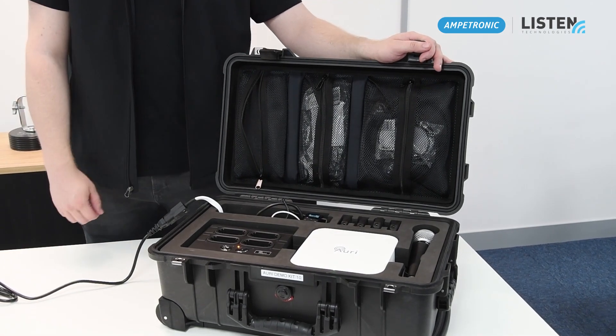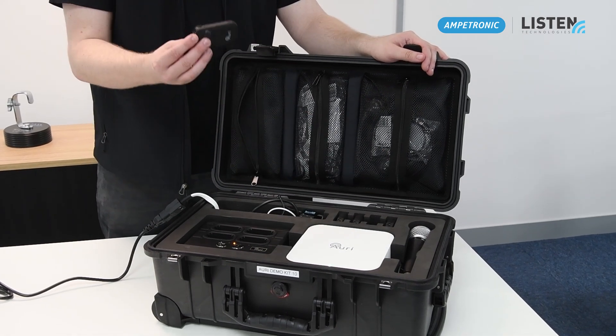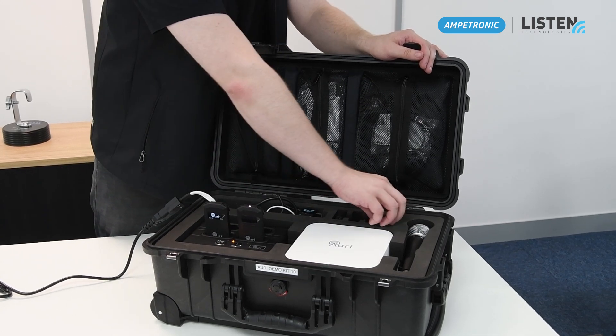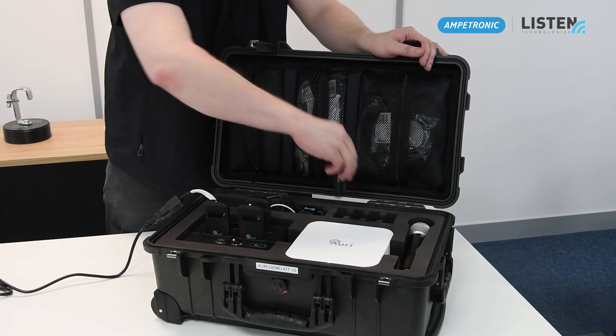Now before I do any demonstrations for customers, I want to make sure that I'm fully charged up on my receivers, so I'm going to take them out and place them within the dock. You should see them light up with a flashing white light at the top of the device.